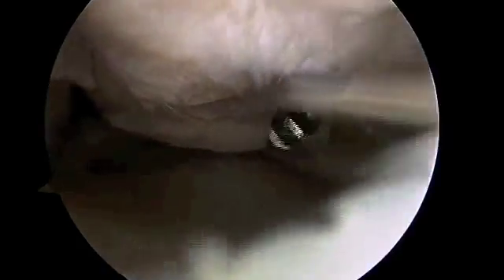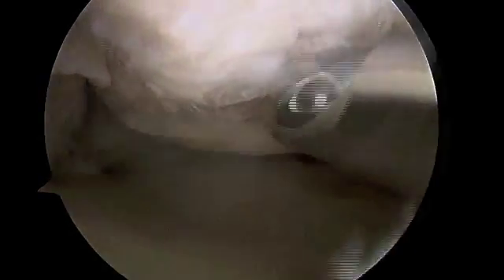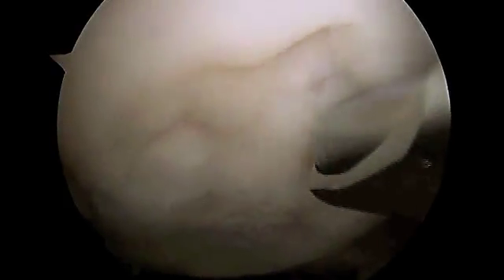Back to the rotary shaver — we're going to just barely use the side of a non-aggressive shaver to catch the unstable portion and remove it. We don't want to take any normal articular cartilage, just the part that's going to break off eventually and become a loose body and float around the knee. We want to address that. We've cleaned out all the loose bodies that we see as we're doing the scope. So just very carefully catch the edge — this unstable articular cartilage will eventually become a loose body if not addressed at this time.